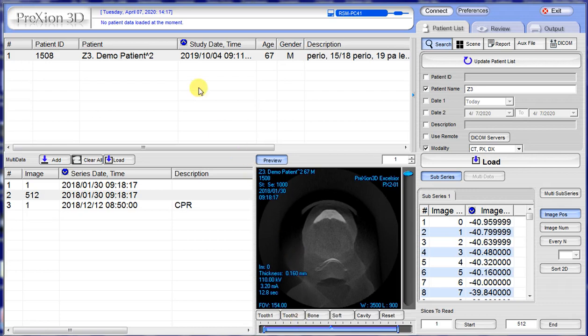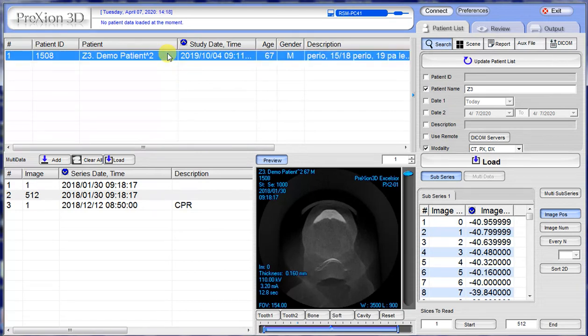Hello everyone. In this video, we will show how to edit or delete patient information. So here on the software viewer page, we have a sample patient. We click once and it highlights blue.